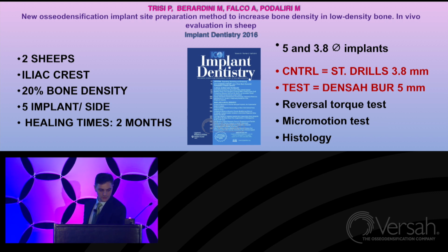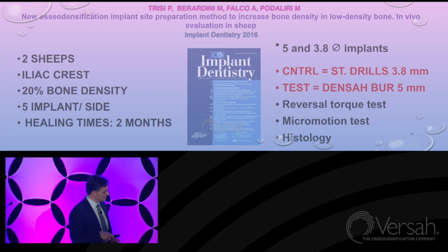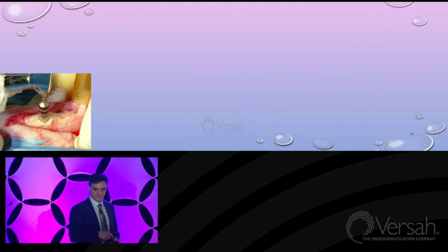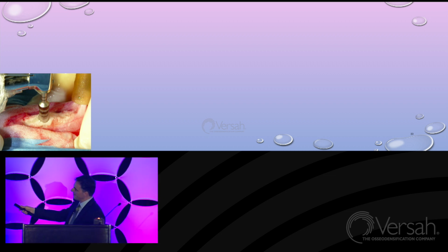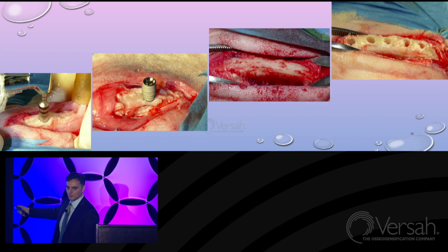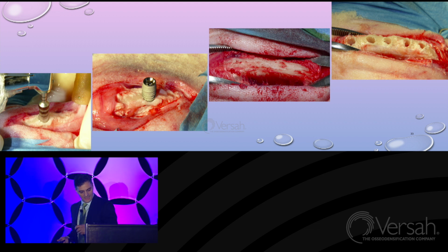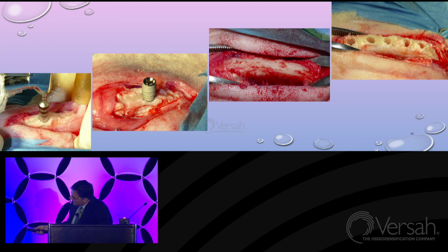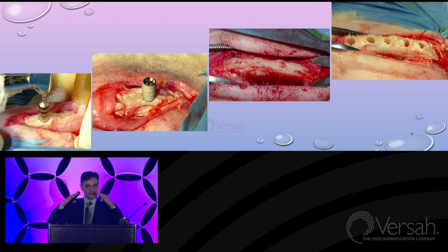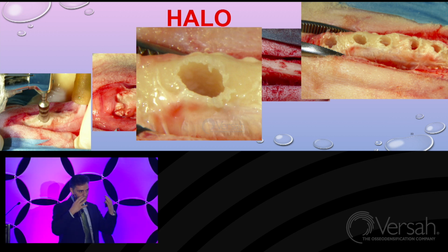Let me show some clinical pictures. This is the crest, prep drilling, implant site insertion, before drilling and after drilling. Can you see the difference in the shape before and after? Can you see all this? I would call this a volcano, because it looks like a volcano. I have done a magnification of this one. Salah called this a halo. But what you see is like an overgrowing of the bone above the crest. It's a strange phenomenon. I cannot explain it, but that's what you find.